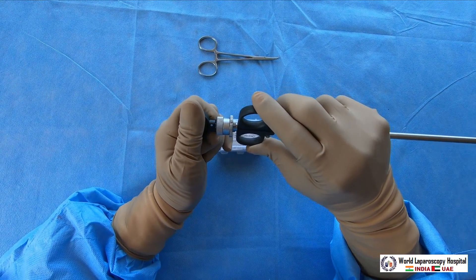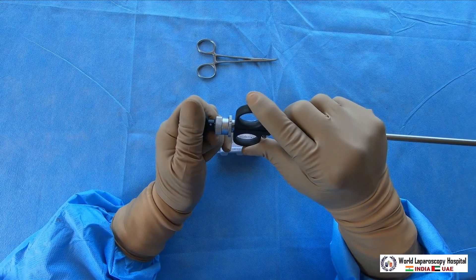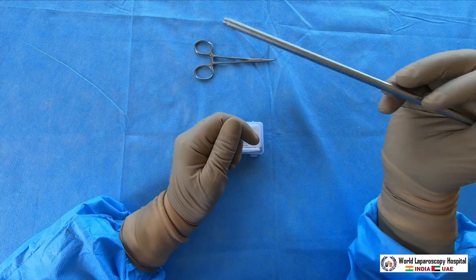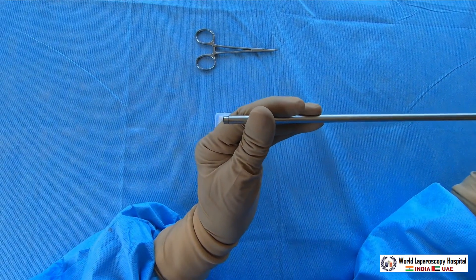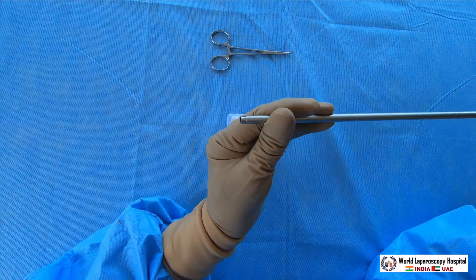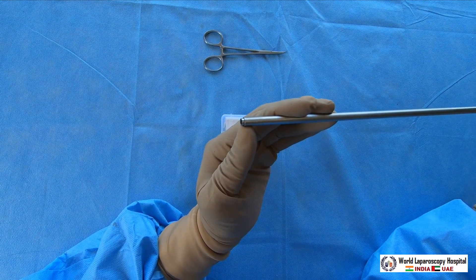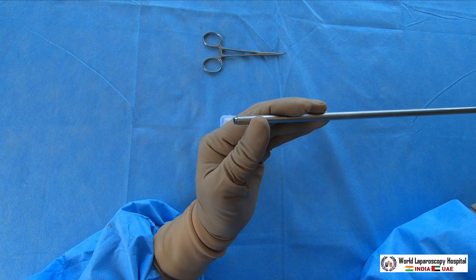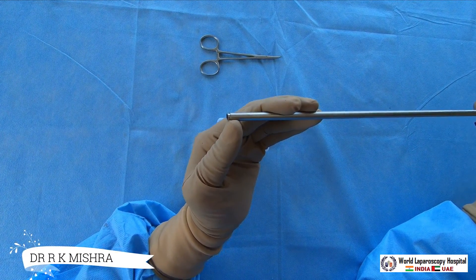The advantage of position number one is that the handle will not go fully in — it will stop halfway. So only the distal part of the fallop ring will be thrown over the tube, and the proximal part will still remain loaded. If I press it now, you can see it is going only halfway in and the remaining half is not going in.